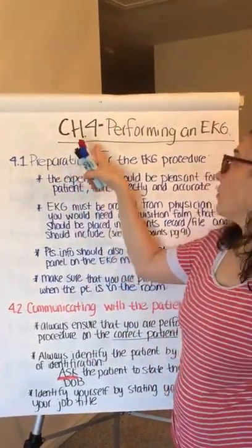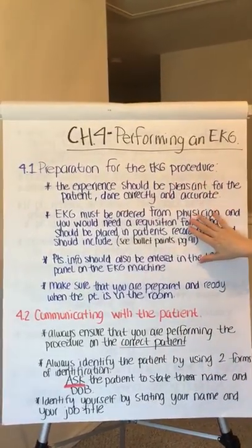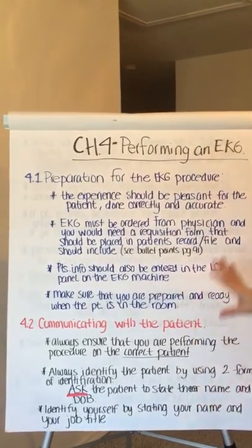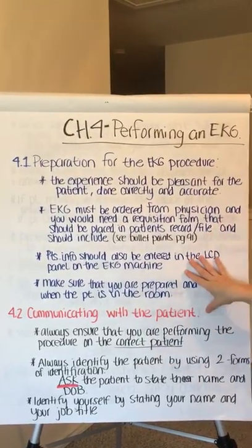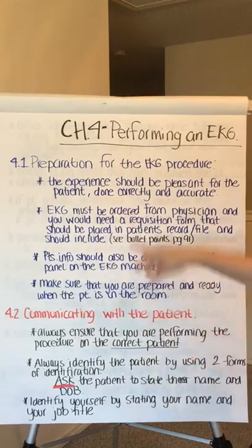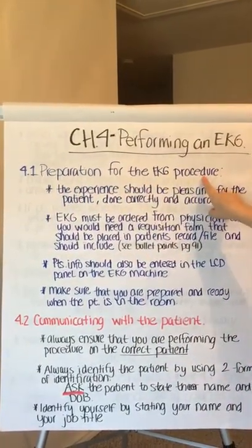We're gonna do chapter 4, performing an EKG. This is to prepare you on how to do an EKG, and I'm gonna go step by step. If you have any questions, please post them in the chat and I can answer them, or if you need to, go ahead and call me. So let's start. Lesson 4.1, preparation for the EKG procedure.